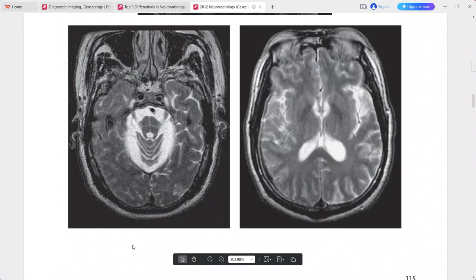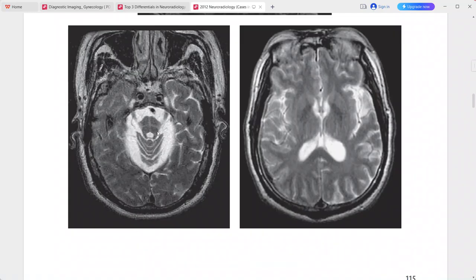Differentials include olivopontocerebellar degeneration and spinocerebellar ataxia.